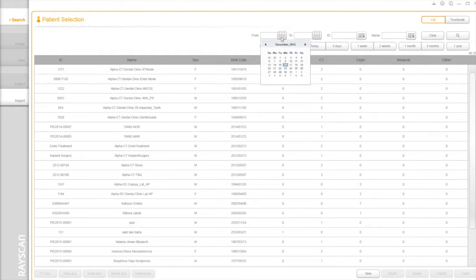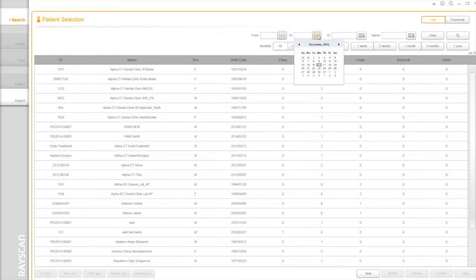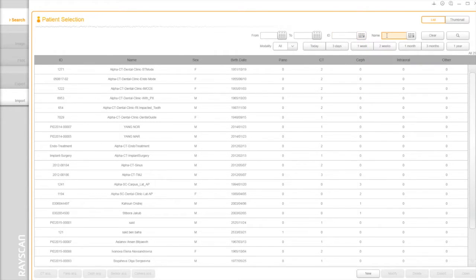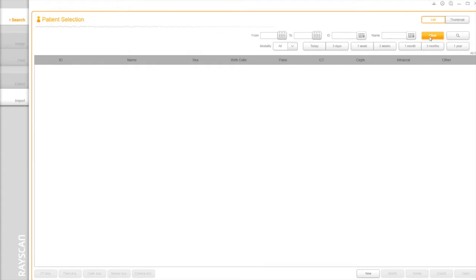You can search the patient with specific dates, ID, and name.